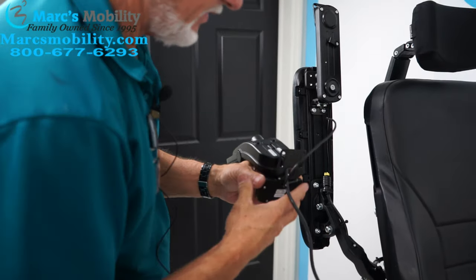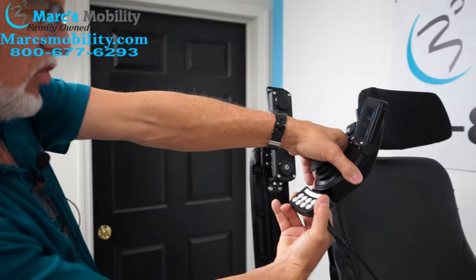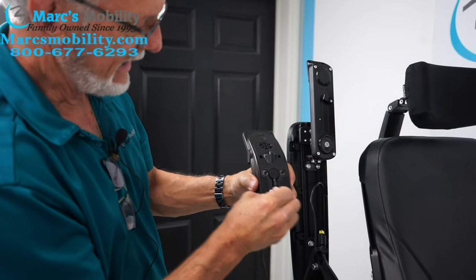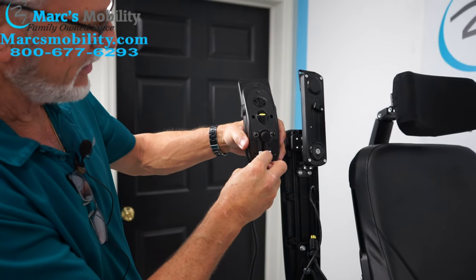I'll send you a few zip ties with it. Now you've got the little box that was sitting right behind your joystick like this. We're going to slide it down over here and wiggle that cable out of here. The cable came out.